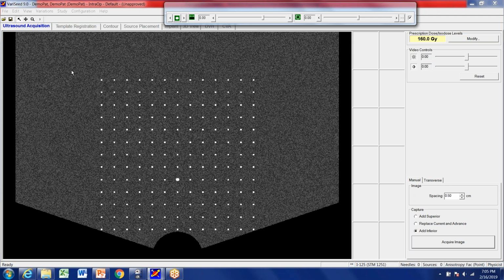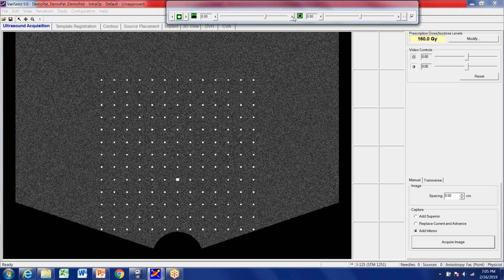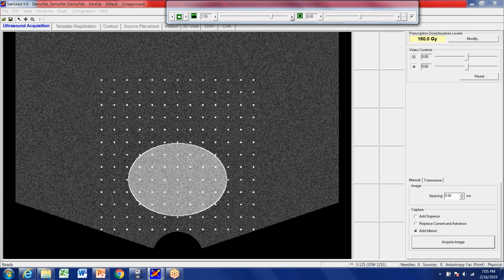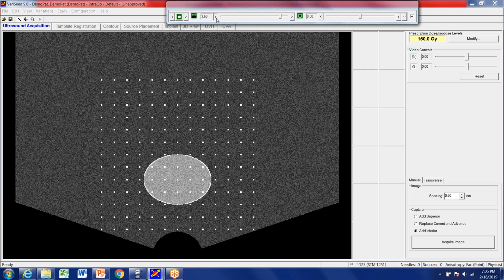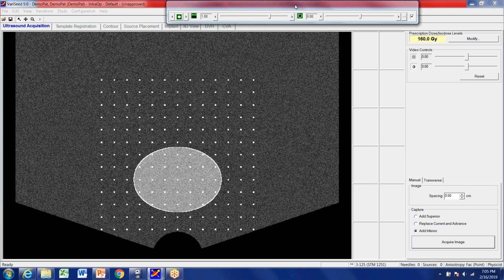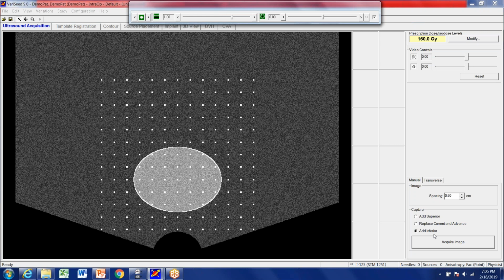What happens is that the radiation oncologist does the study. So okay, we have this volume, and after doing that, click. You start acquiring your images.